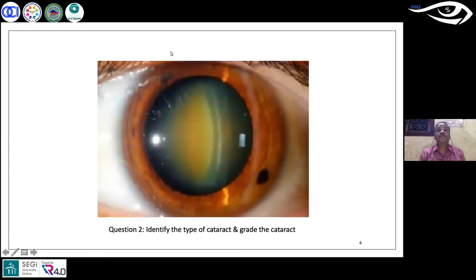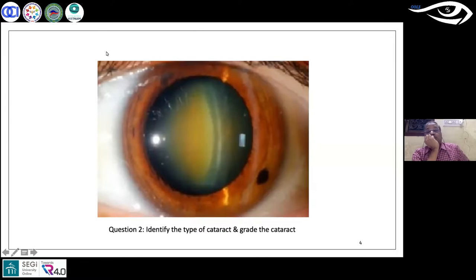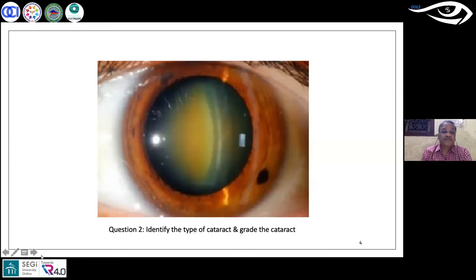For the second poll question, the image is on the slide — identify the type of cataract and the grade. The four options are PSC grade one, PSC grade two, NS grade three, and NS grade two. More than half — 53 percent — think it's nuclear sclerosis grade three, with 8, 24, and 16 percent for the others.